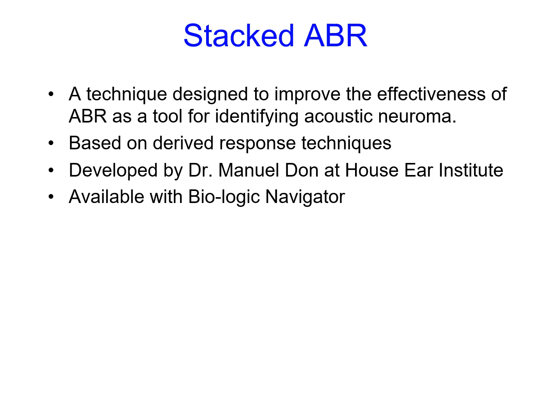Now let's go over stacked ABR, the second automatic ABR procedure. Stacked ABR is a technique designed to improve the effectiveness of ABR as a tool for identifying acoustic neuroma. It is based on derived response techniques and was developed by Dr. Manuel Don at House Ear Institute.